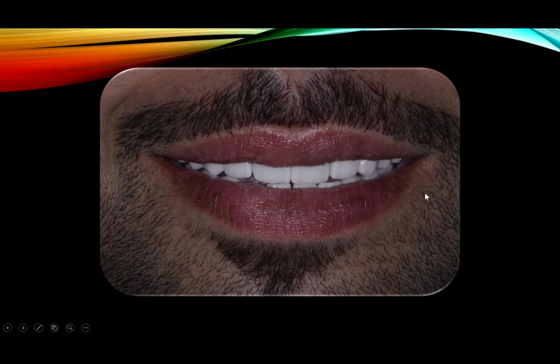on this case. This is after cementing the upper and not cementing the lower. That's why the lower doesn't look good. The lower is not cemented. We cemented the upper and the lower came back for a bit of adjustments, occlusal adjustments and stuff.